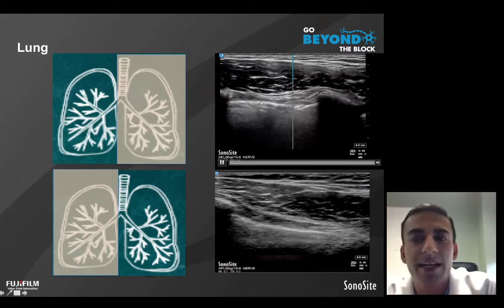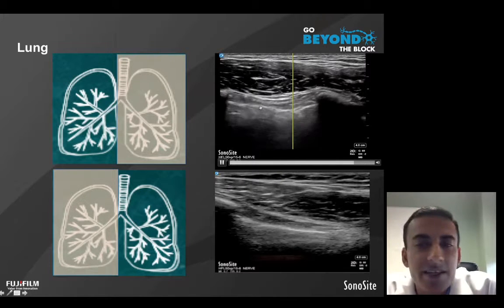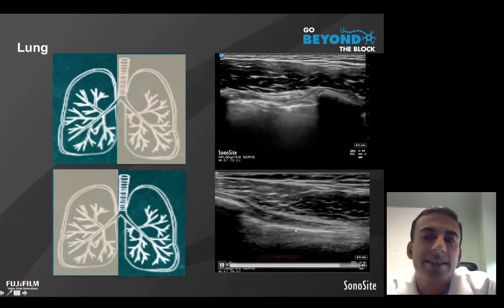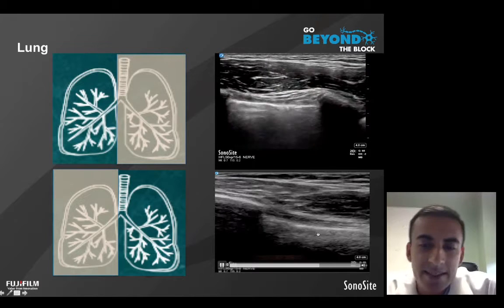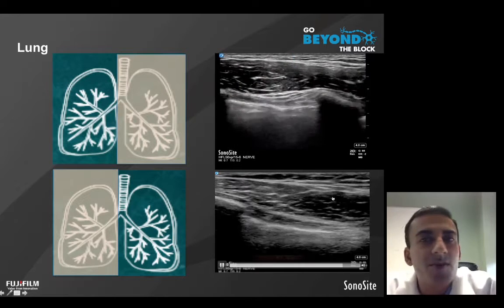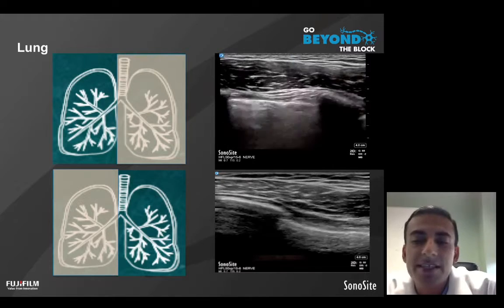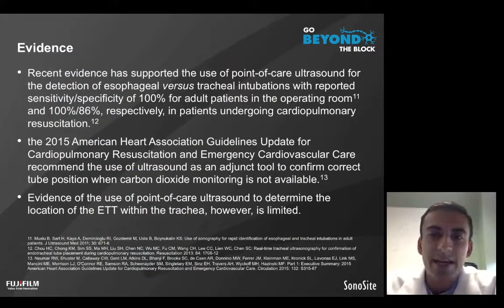Specifically, what we're looking at here is the lung pleura line, and we're seeing the sliding effect of the visceral and parietal pleura as the lung is expanding in an appropriately aerated lung bed, compared with the other side here, where we are not appreciating lung sliding, or that visceral and parietal pleural sliding motion, because the aeration to that side is different or poor. And again, we'll talk about this in further detail in our subsequent slides.